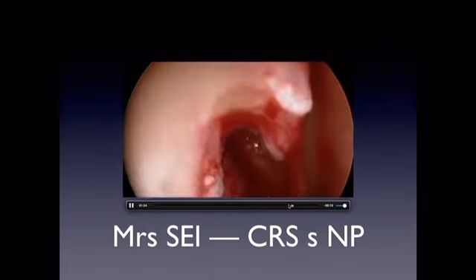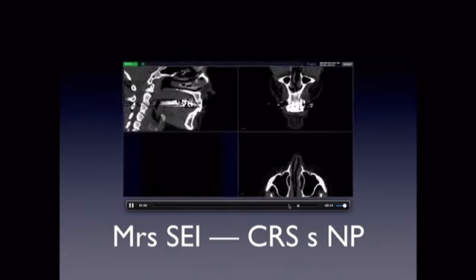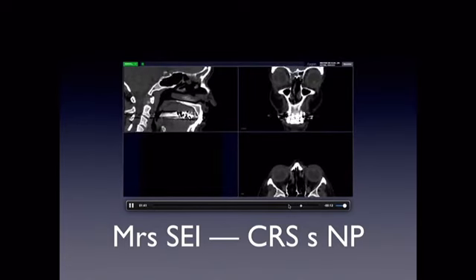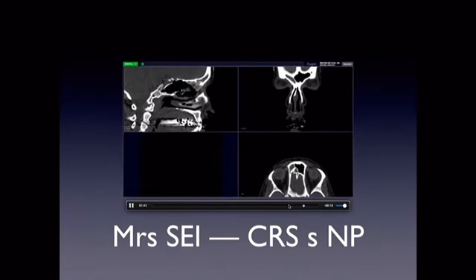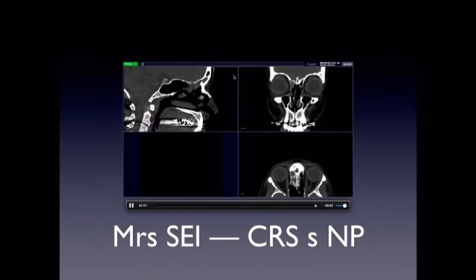And at the end of the video, what we'll be able to see is quite nice up into the frontal sinus. And then the stealth navigating instrument up into the apex of the frontal sinus. So that's where you see that little X, I don't know if you guys can see that green X there, the cross mark. That's me up into the frontal sinus. That means we've been able to get up all the way through where we need to be.